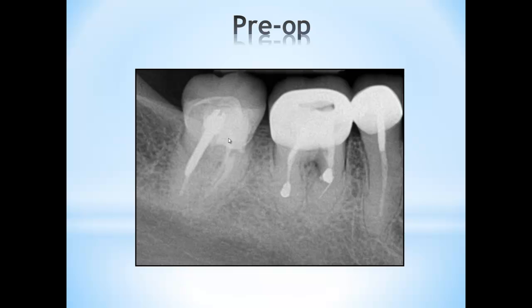But you will see that when the patient came back for her regular checkup and we took a bite-wing x-ray, you will see how the margin fits. So everybody will make mistakes. I made a mistake, and I want to share with you how to approach the case.